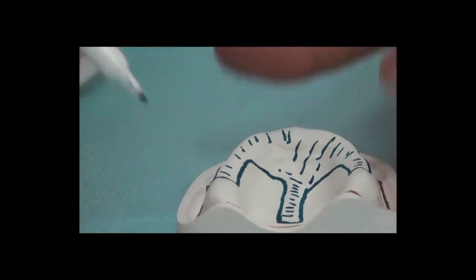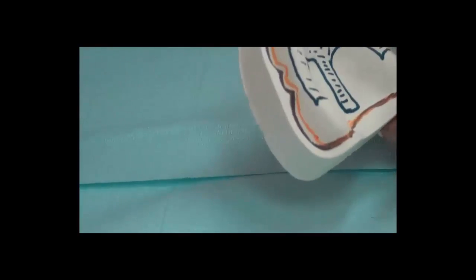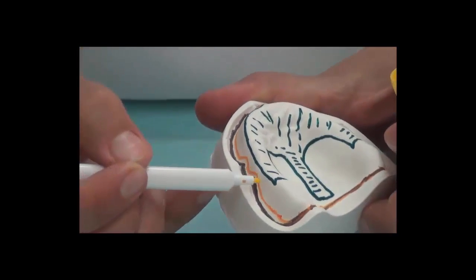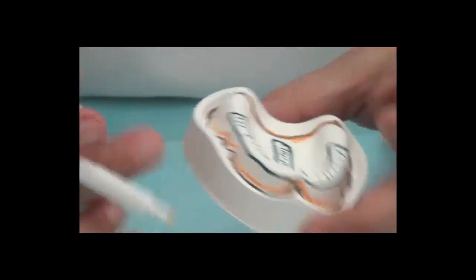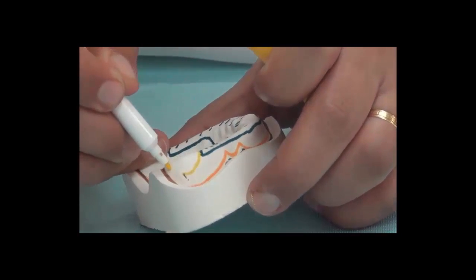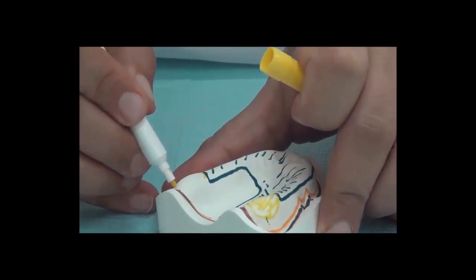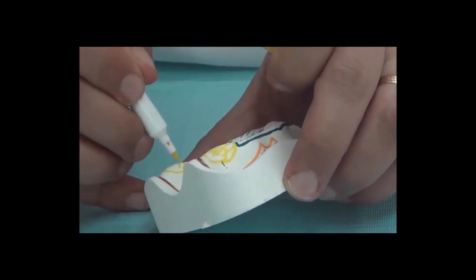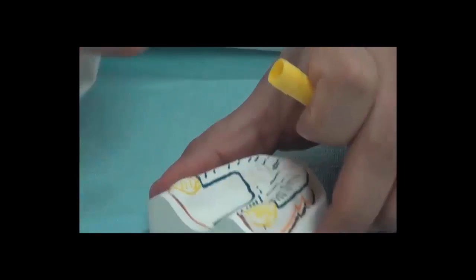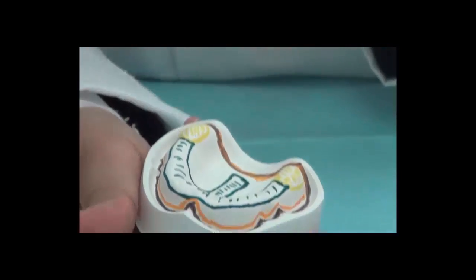Now the areas in white between the border of the wax and the border of the tray are all primary support areas, where the impression will be in a muco-compressed status, okay? Except for the tuberosities, called the secondary support area. These tuberosities are also in close contact with the tray material. We're not going to do anything on them, but I'm coloring them in yellow just to differentiate them from primary support areas. So whatever is in white is primary support area, including the slopes of the ridges. This is for the upper.